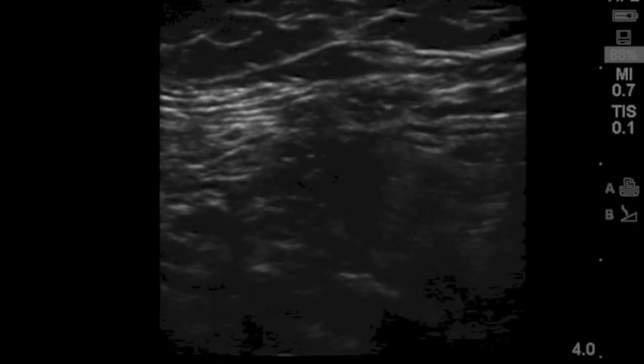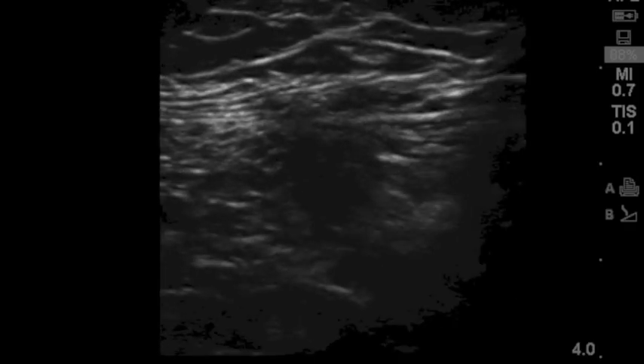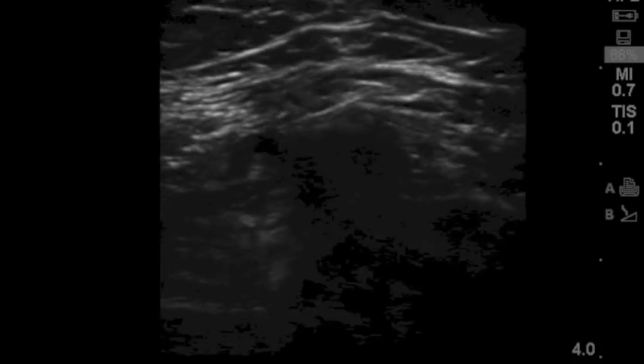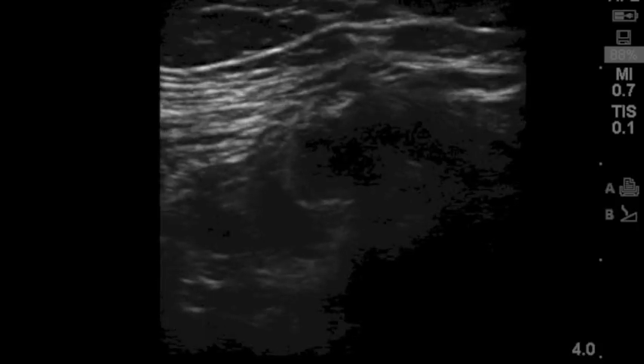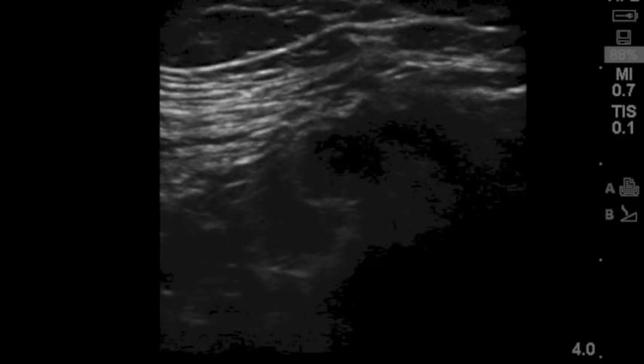This is Dr. Steven Finkel from Stanford School of Regional Anesthesia. In this live block video showing the fascia iliaca block, you can appreciate the needle coming from a caudad to cephalad position, from the right side of the screen toward the left. The goal — as you can see with injectate already being expressed on the screen — is to have the needle tip sitting just underneath the fascia iliaca. As you begin the injectate, you are gently hydrodissecting underneath the fascial plane in a cephalad manner to ensure proper spread of local anesthetic into the proper compartment.